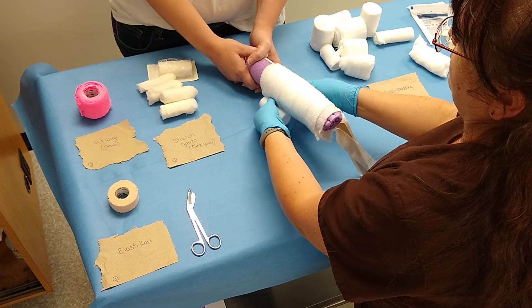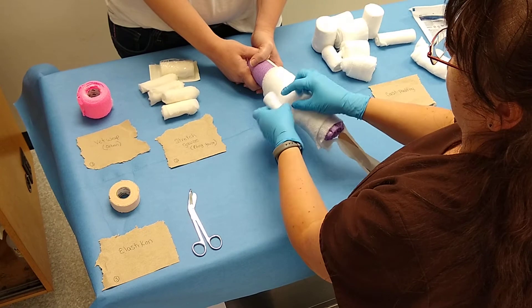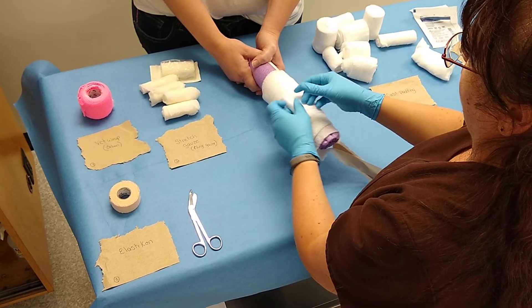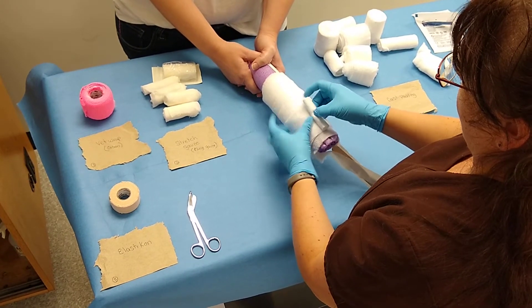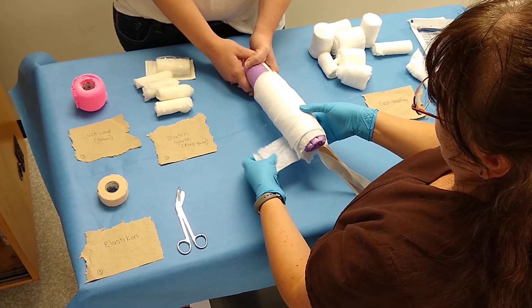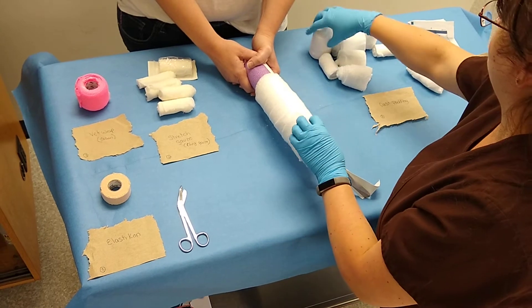It is also used as a step-down bandage from your Robert Jones. Notice I'm still going to place several layers of cast padding on here. You still want to overlap it and you still don't want to put a lot of creases in it.